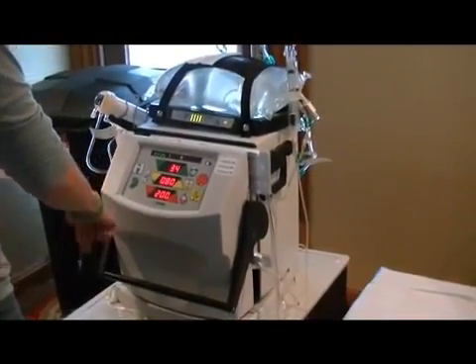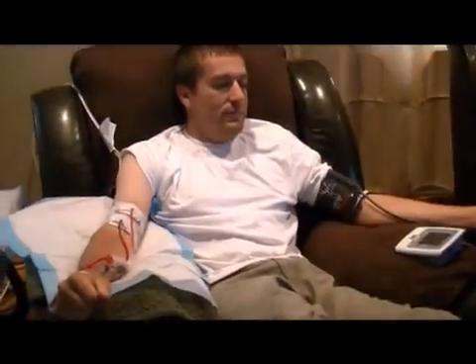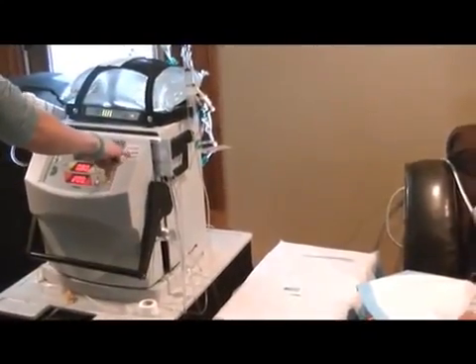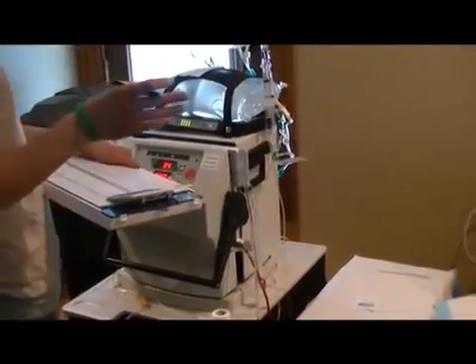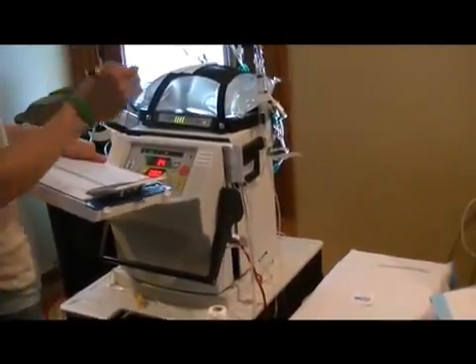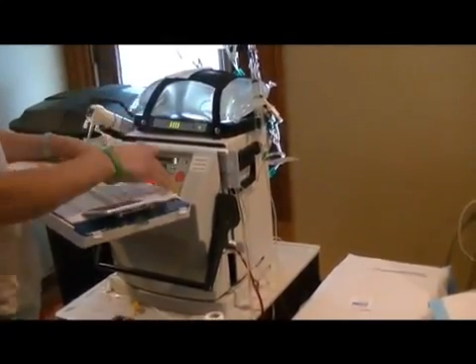And as it starts, he always does his blood pressure at the very beginning. And we record that, and then I watch the numbers for the pressures on the machine, and I have a little thing here that tells me it can't be over what numbers if the pressures are too high. And then I record all of the numbers, record his blood pressure, and every 30 minutes the machine kicks down and does a double check of everything, does all the sensors, and we do blood pressure and write all the numbers at that same time.